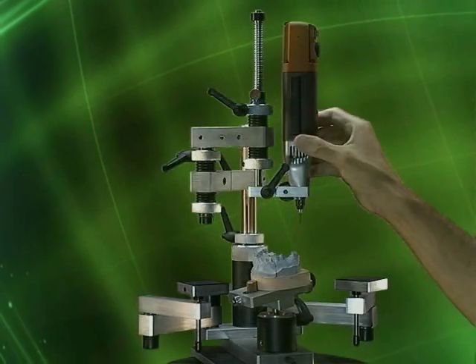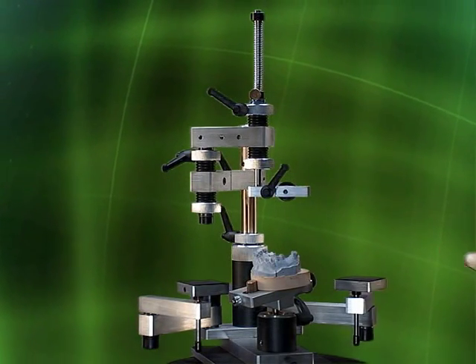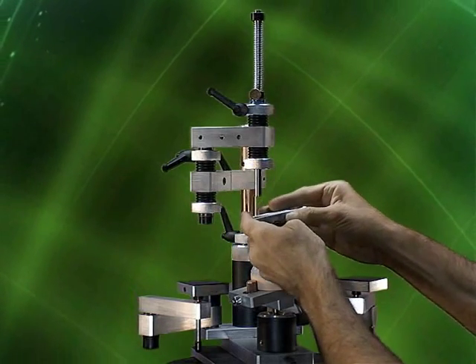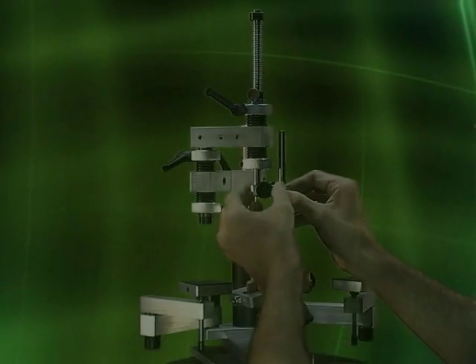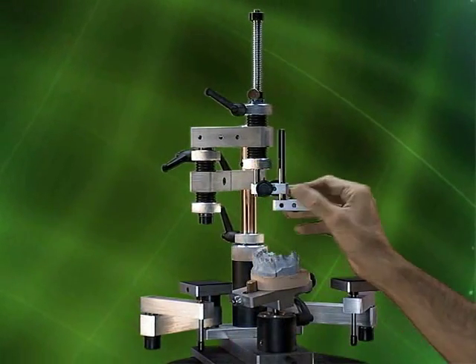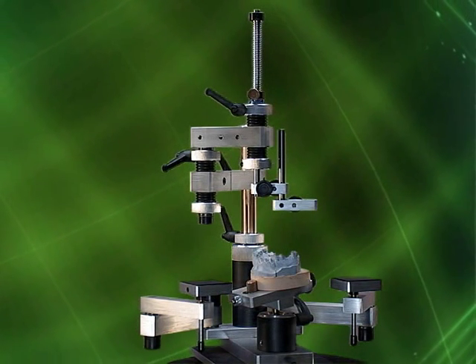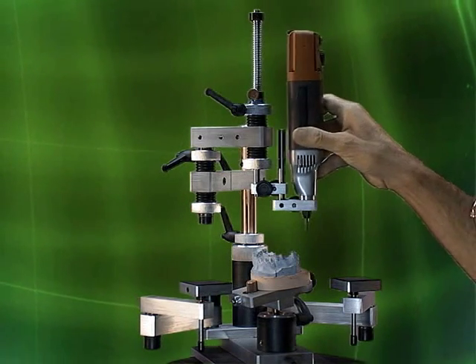You can install the Z-Axis attachment. You start by removing the motor and the standard motor arm and replace it with the Z-Axis attachment. Reinstall the motor and lock it in place.